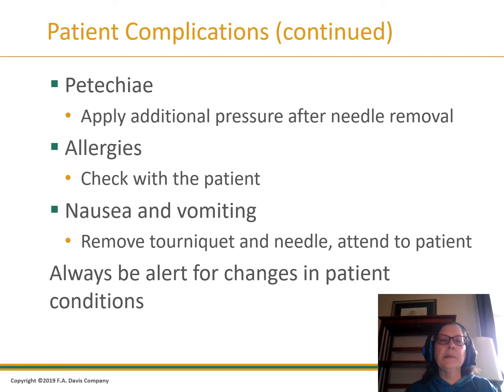If the patient has petechiae on their skin, you may need to apply additional pressure for a longer period of time after venipuncture to stop the bleeding. If a patient has an allergy, it is important not to use equipment that has this allergen. Latex and iodine are allergens to be concerned about. Most hospitals do not have latex products in the facility. If you do have latex equipment, you should know what it is and not to use it with people with that allergy.